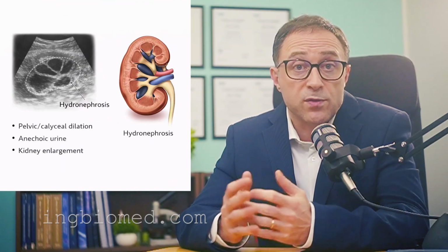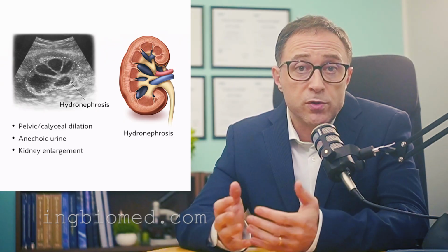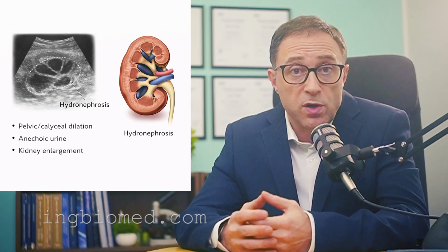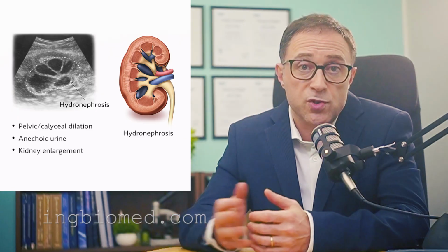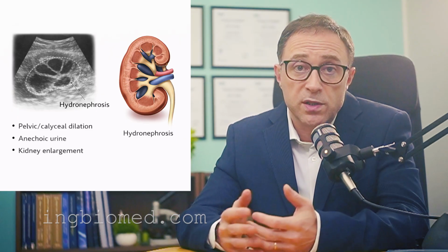And now, let's address urinary obstruction. In normal conditions, the collecting system is not dilated. In early obstruction, we observe dilation of the renal pelvis. With progression, calyces become dilated, and in advanced stages, the parenchyma thins due to compression, culminating in hydronephrosis. Chronic bilateral obstruction may lead to severe functional impairment requiring dialysis.